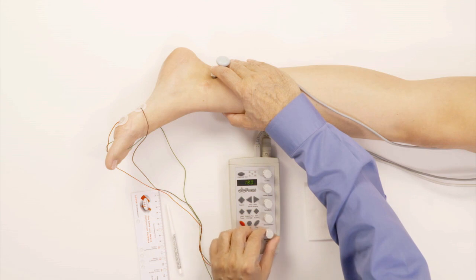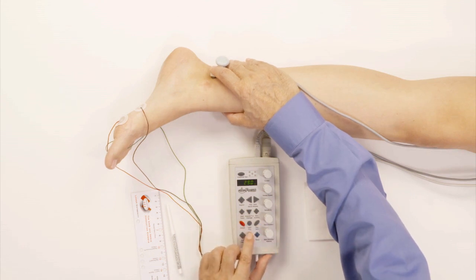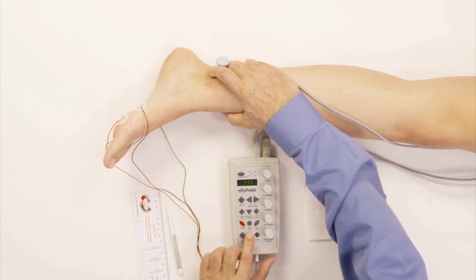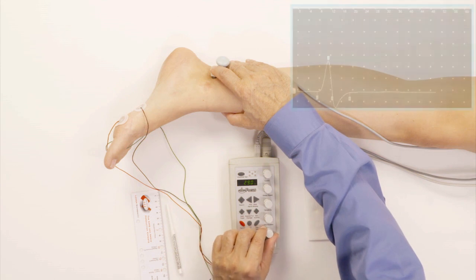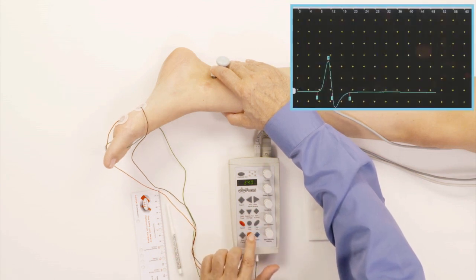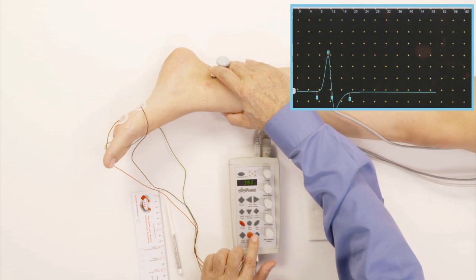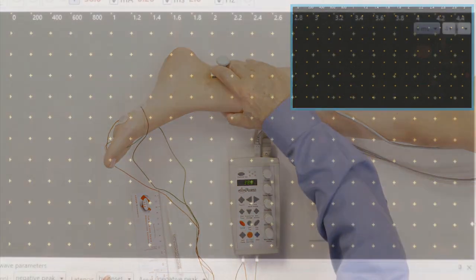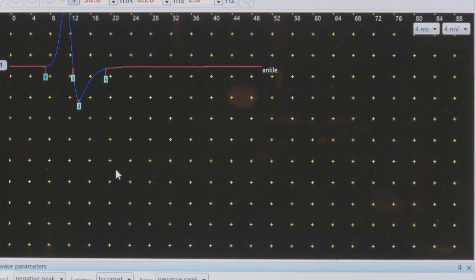I'm increasing the stimulus. We got a very nice response right away. Still building up. I accept that. And basically that's the tibial nerve, the tibial motor.